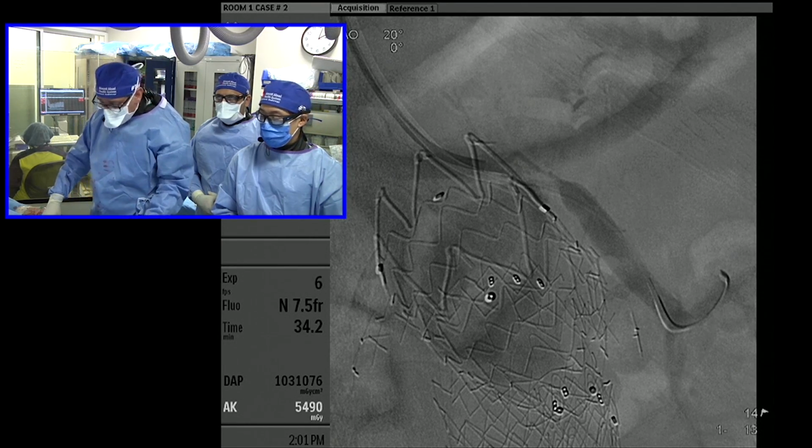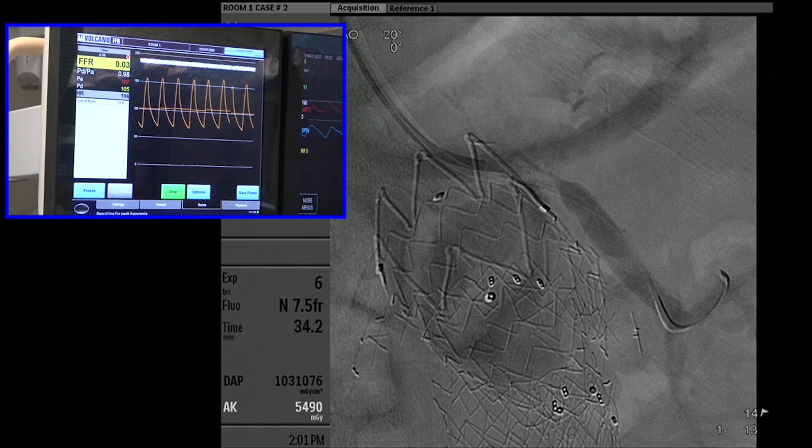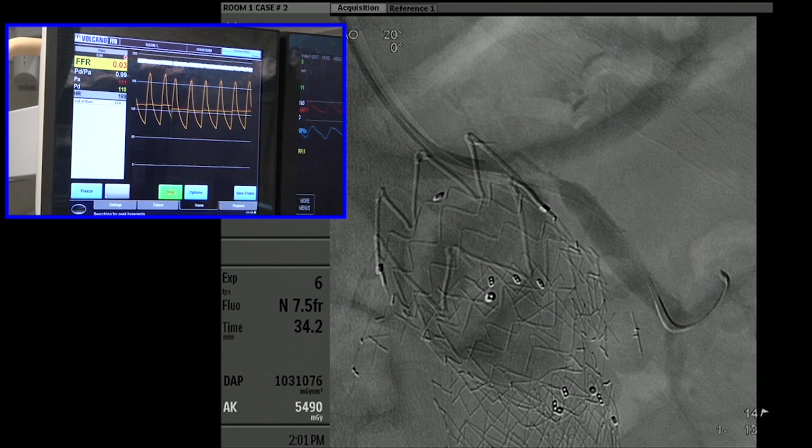And then what we've done is we've introduced a second guide wire. I have a support guide wire in the renal artery. That's the first guide wire that we used to cross. I think there was a fluoro run of us crossing the renal lesion. And interestingly enough, even though this lesion looks so complex, the guide wire actually sailed right through. Interpret that how you will.